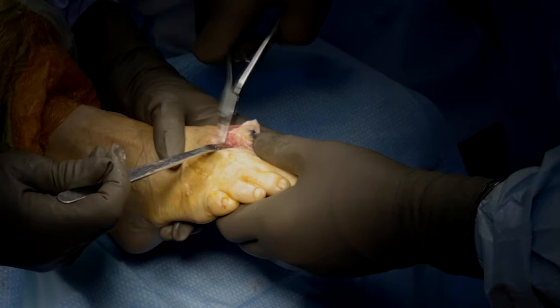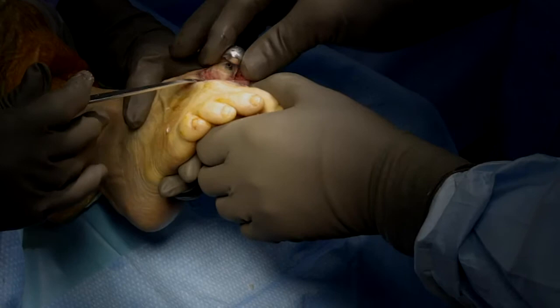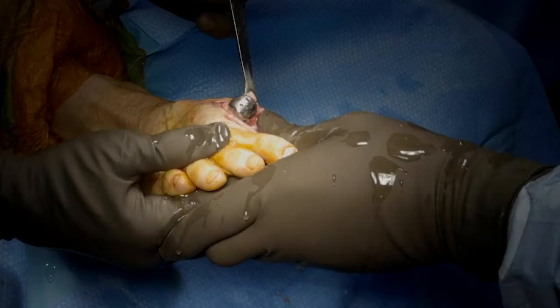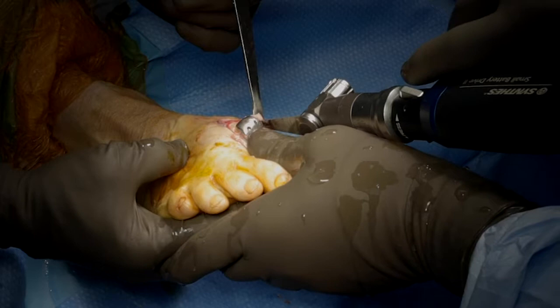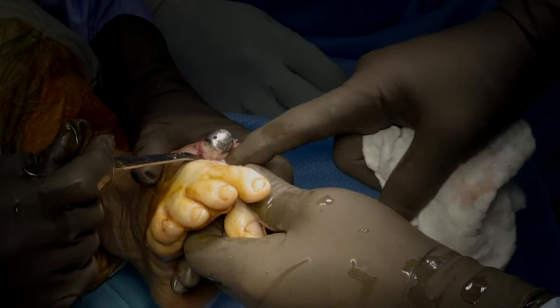Now I take my trial implant — the 4.5 by 1.5 implant — and put it right inside the post so it sits in its place. That tells me how my implant is going to look. I don't want to leave cartilage on either side that might potentially become arthritic — we wouldn't do it with a knee replacement so I'm not going to do it here. My thumb is going to sit right in where the medial sesamoid is going to sit, and I don't want to take that out because it'll give stability. I take a saw and cut off any extra bone on each side. The articular surface plantarly looks great and it comes straight up to the implant in one nice smooth flow.